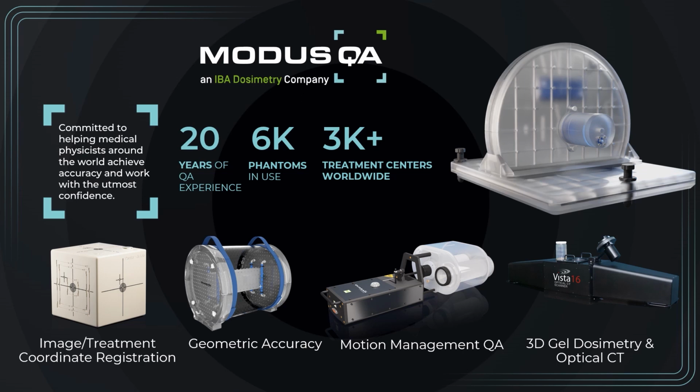In more recent news, just earlier this year, we officially joined the IBA dosimetry family, enabling us to really expand the future possibilities for our customers in both medical imaging and radiotherapy QA. With our team's combined knowledge and passions, we will continue to deliver the critical QA tools and software needed to ensure the best care and the best possible outcomes for patients.